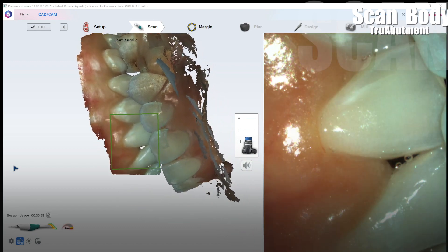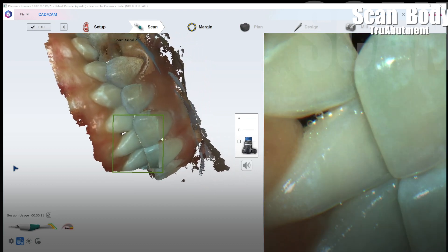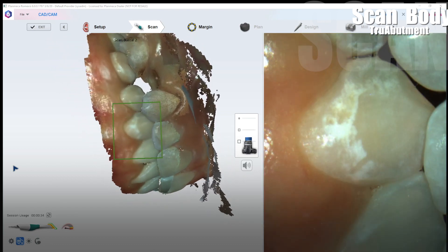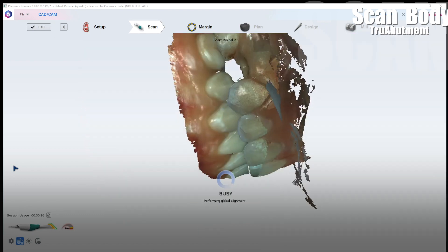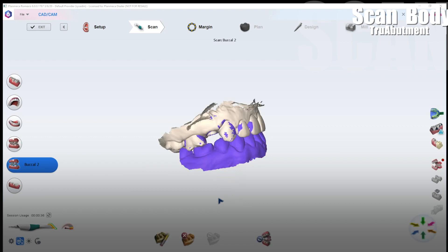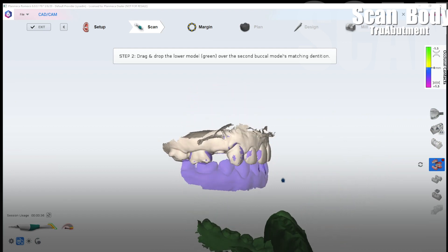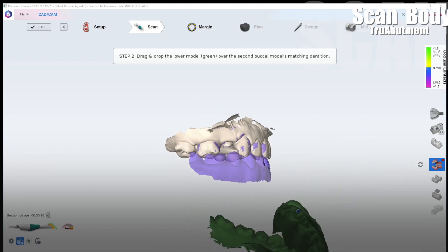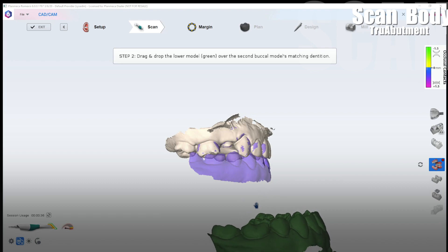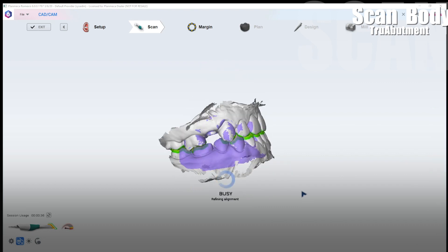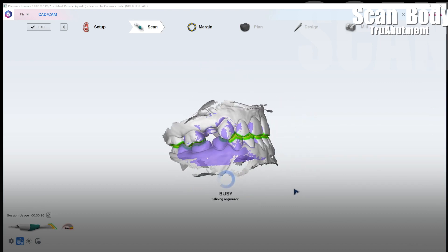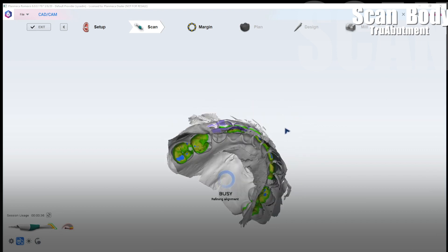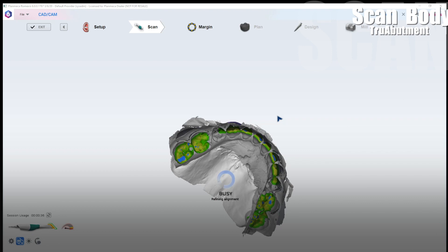So to manually pin the bite it's actually really easy. So it's clear that I'm not going to be able to get an automatic alignment of the mandibular arch onto that buccal bite number two. So all I'm going to do is go ahead and go to the little generate model icon. Then I'm going to go ahead and go to my bite tab here and see the red dot rather than a green dot. That's indicating that I did not get a good merge. So I'm just going to rotate and manipulate that lower model and then click a common point in each and let go. You'll see that's going to snap right in and automatically start fine tuning those bilateral bites.